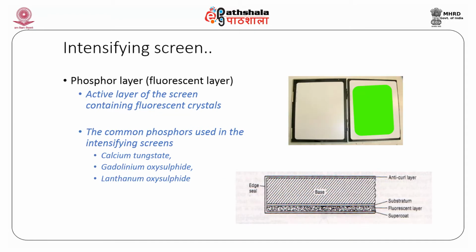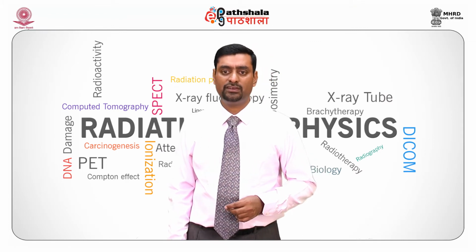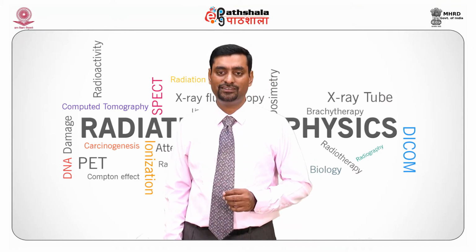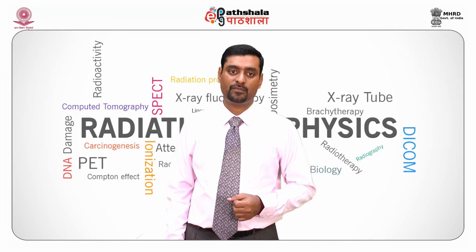Now we come to the active layer in the intensifying screen, which is the phosphor layer or the fluorescent layer. This is the active layer containing fluorescent materials. Commonly used are calcium tungstate, gadolinium oxysulfide, or lanthanum oxysulfide. The green light which is seen here is because when X-rays fall onto this intensifying screen, it emits green light.